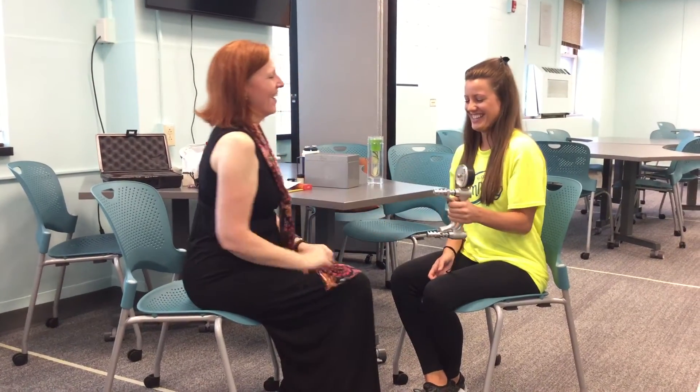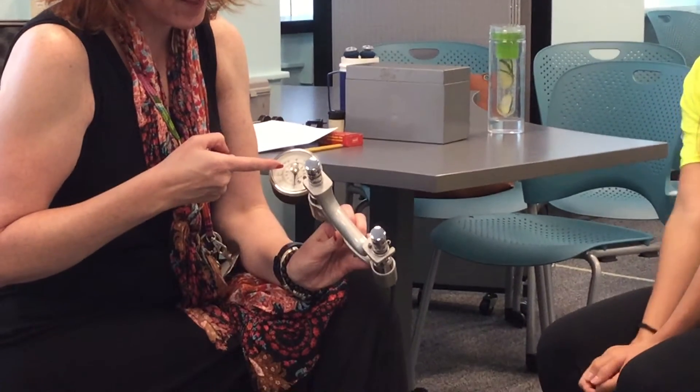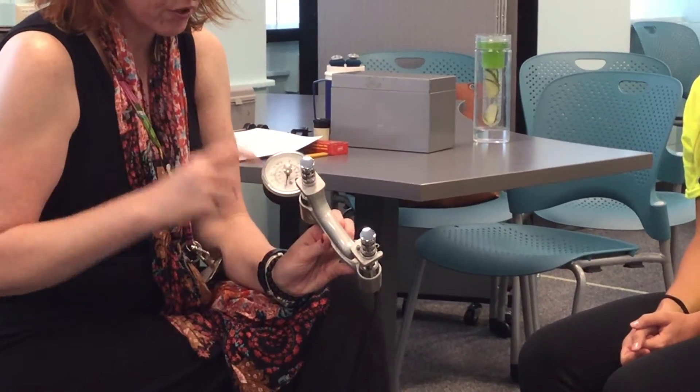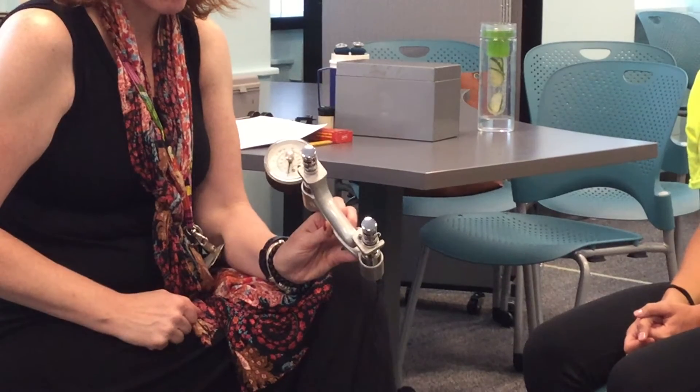That one pulled a 35 — let's redo that. There we go, 64. You can call a redo because you're like, wait a minute, that's an outlier. What ends up happening is there is a little needle that follows the actual pressurized needle, and that's what you're actually seeing. And of course you want to make sure you reset it down every time.